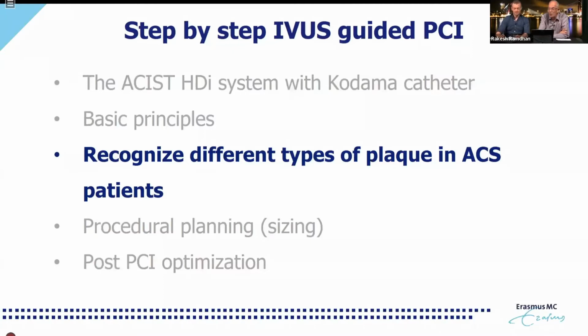So if we go to the next, then here we have the program for today. As you've seen in the invite, the focus of today will be on plaque recognition in patients presenting with acute coronary syndrome.